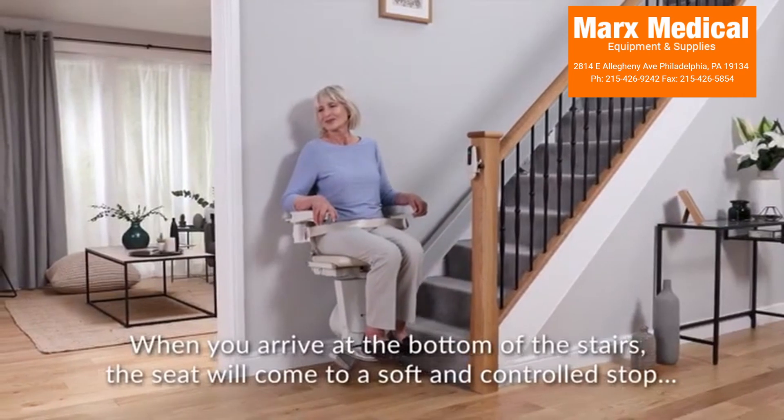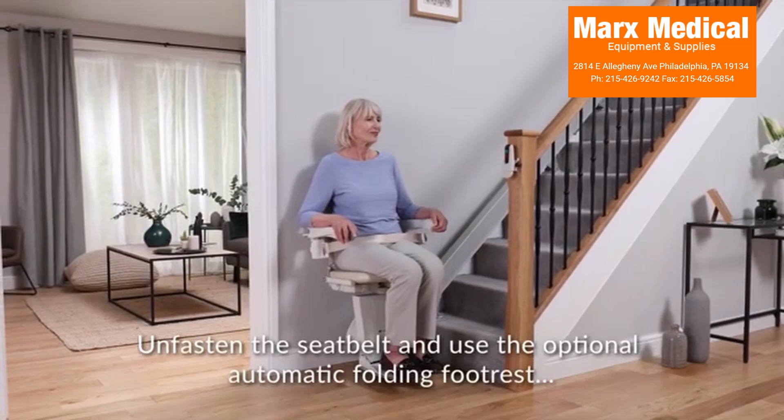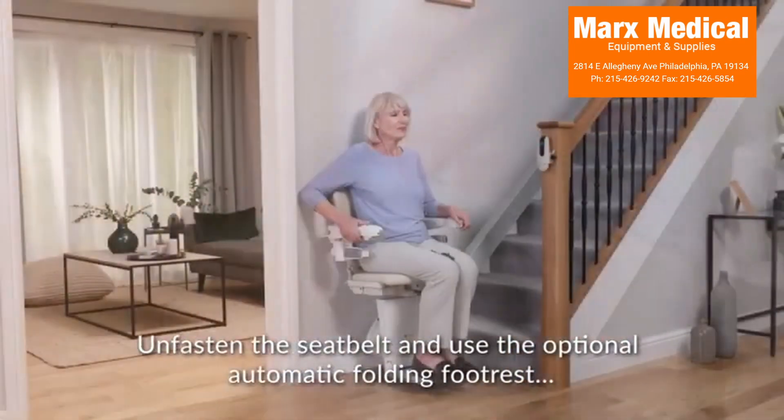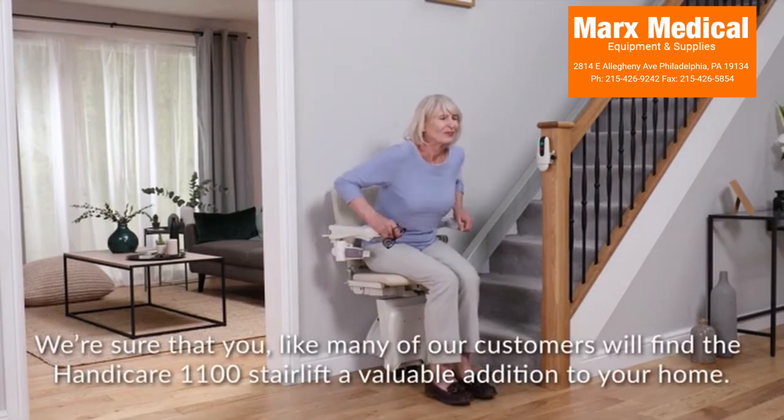When you arrive at the bottom of the stairs, the seat will come to a soft and controlled stop. Unfasten the seatbelt and use the optional automatic folding footrest to move it out of the way so you can safely stand up.